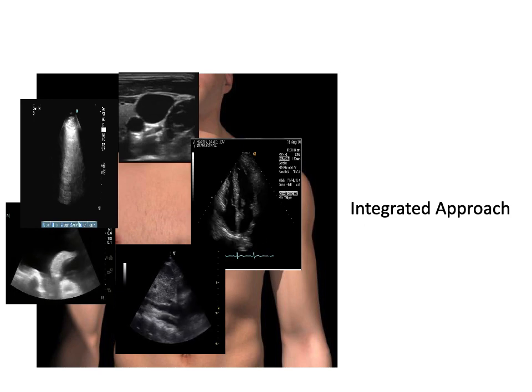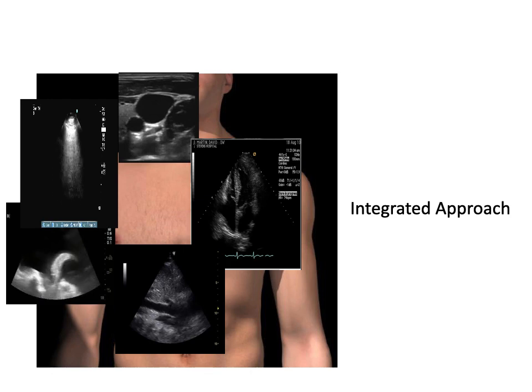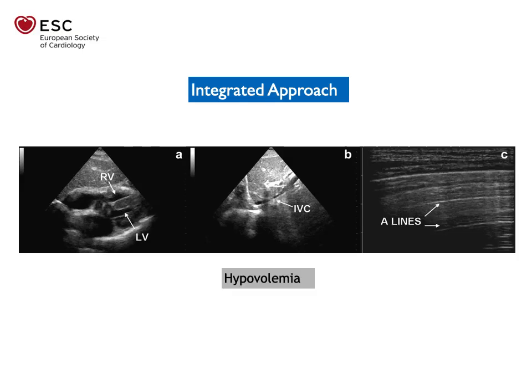It should always be put in the clinical context, and we should integrate lung ultrasound with cardiac study using scanning the heart, the big veins, looking for any venous thrombosis, looking for the venous size as well, scanning the pleura, scanning the IVC.